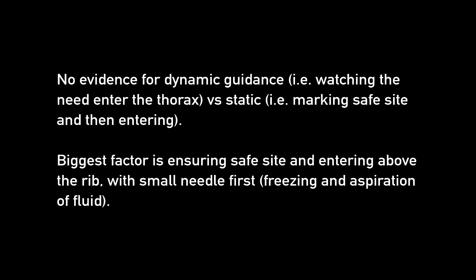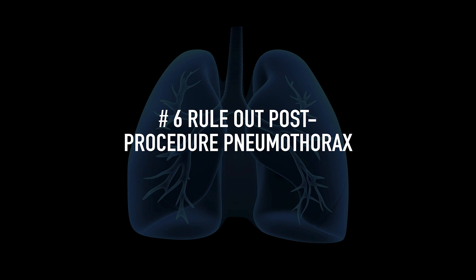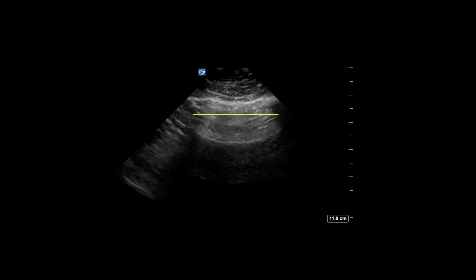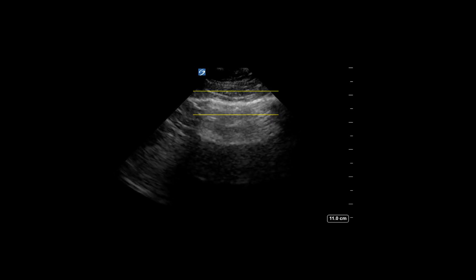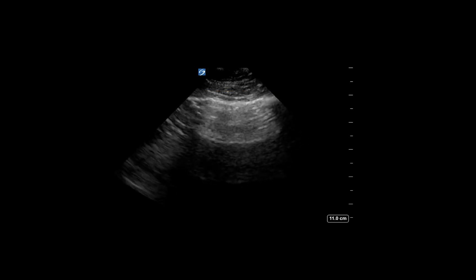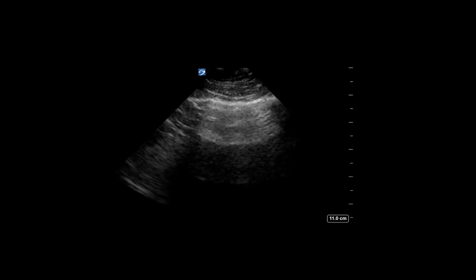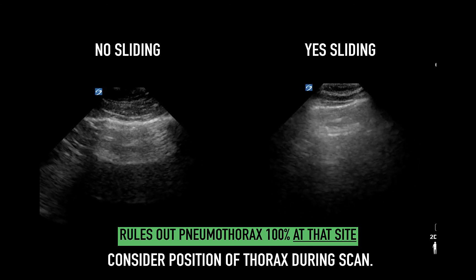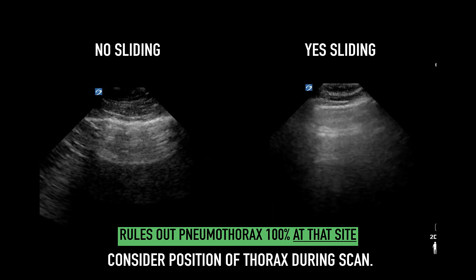The reason proper dynamic guidance is difficult in the thorax is that lower frequency probes, such as the curvilinear probe, make it quite difficult to track the needle tip properly. Finally, you can use ultrasound to rule out periprocedural complications such as pneumothorax, especially if you've not placed a chest tube — look for lack of lung sliding. Perform a pre- and post-procedure evaluation of the pleura to make sure sliding is intact. The position of the thorax matters: if the patient is sitting up, scan more of the apex; if supine, scan more of the anterior chest.